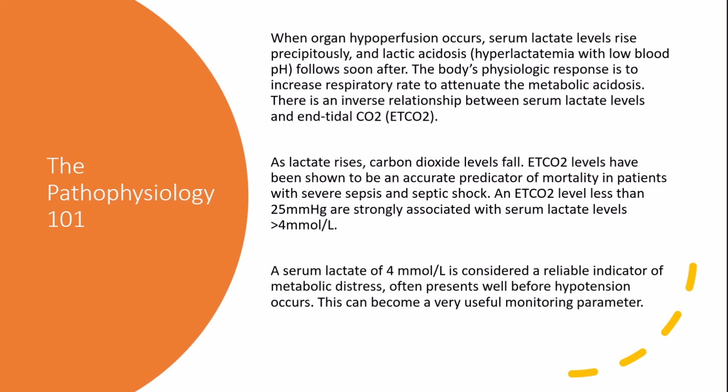Now, when organ hypoperfusion occurs, there's something called serum lactate. Serum lactate rises quite quickly, and lactic acidosis will follow soon after, and that will cause metabolic acidosis. One of the body's physiological responses to try and compensate for this increased acidosis of the blood is to increase the respiratory rate to try and resolve this metabolic acidosis. And so there is an inverse relationship between the serum lactate levels and end-tidal CO2.